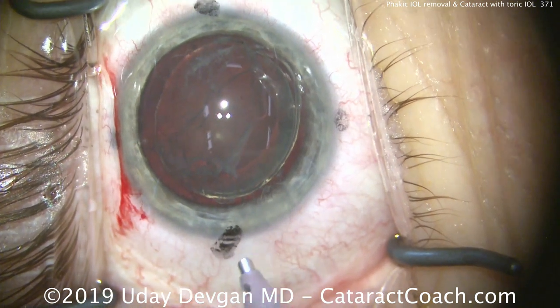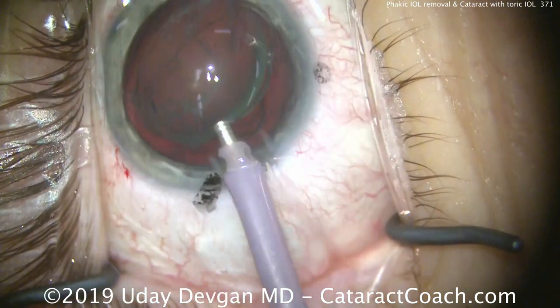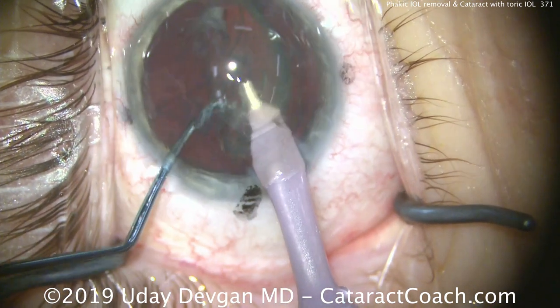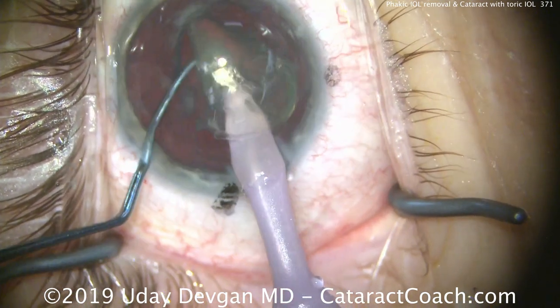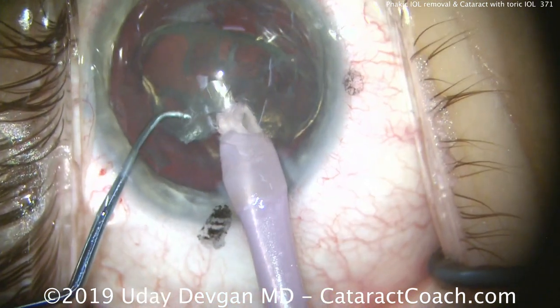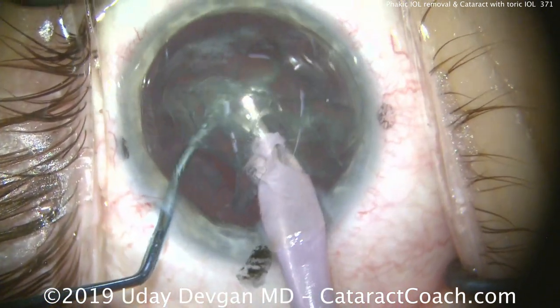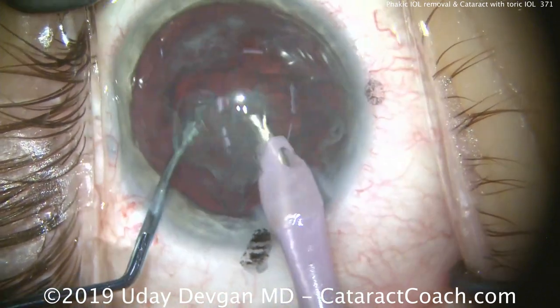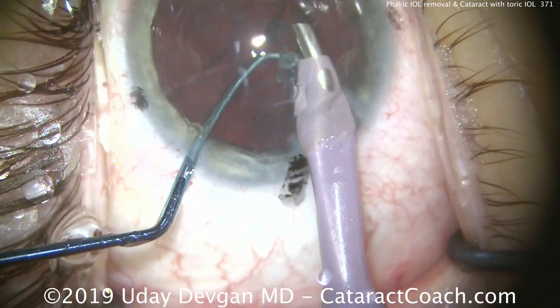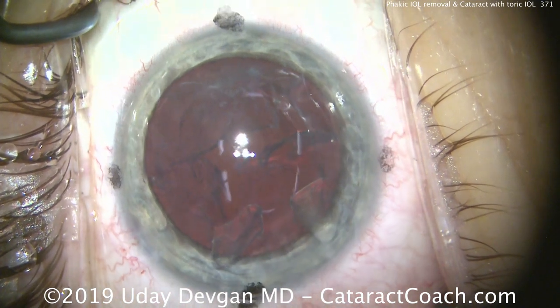These patients are also very myopic — that's why they had the phakic IOL in the first place. So it's important to use a modern method like we've described at iolcalc.com to do accurate lens calculations. Do you need to account for the phakic IOL in the calculations? The answer is no, because we're removing it entirely. When we measure the axial length using an optical method, and since the phakic IOL is totally clear, we're able to measure through it very easily.